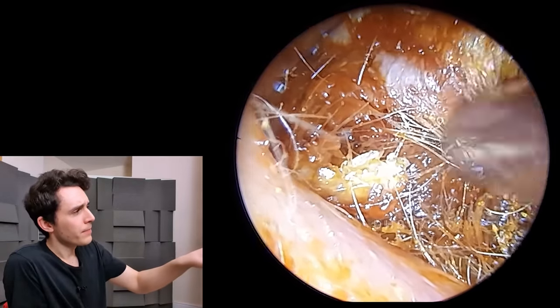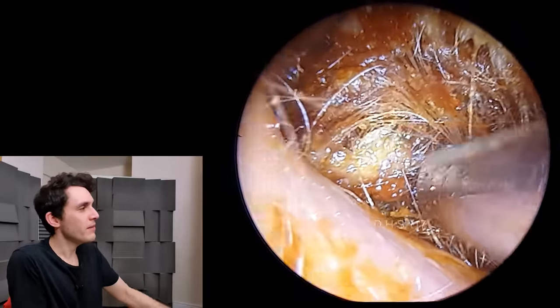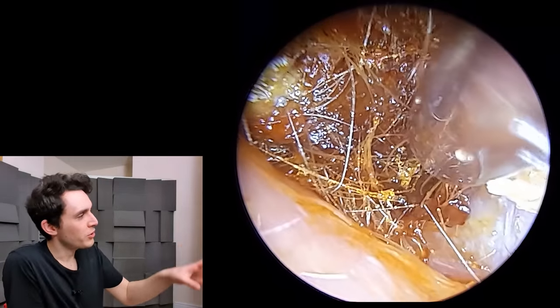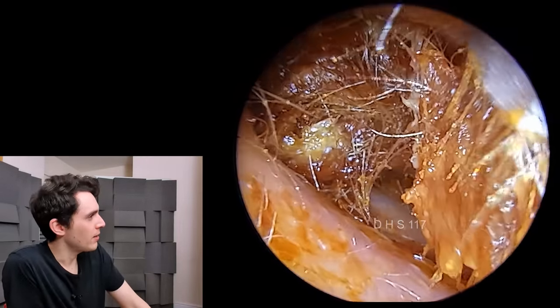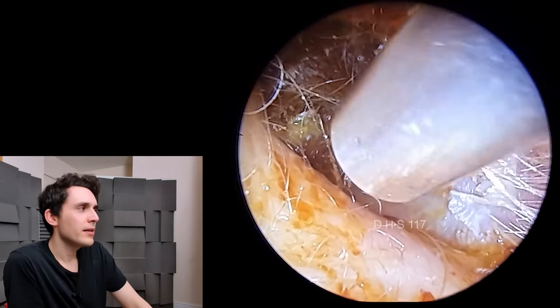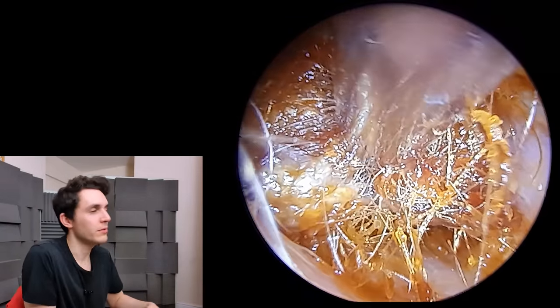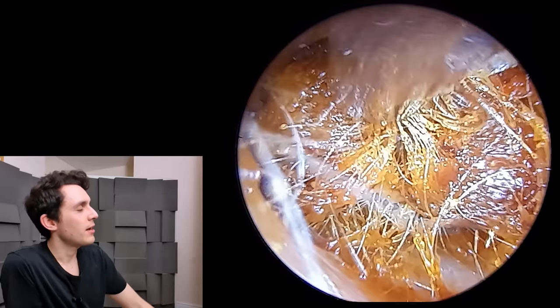What's in the ear is basically a hairball, really. It's a very fine, dense matrix of hair and wax and dead skin. We've dealt with these before on the channel. I've seen a couple of cases like this. It doesn't usually cause that much pain, but this patient is in quite a bit of distress. When the procedure is done, you'll see what everything looks like. The ear doesn't look too bad — there's just a little bit of ulceration of the skin, which was probably causing him a bit of jip.